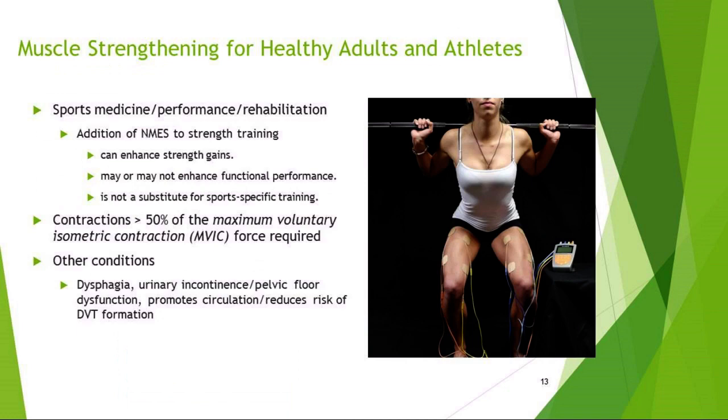So muscle strengthening for healthy adults and athletes, this is very commonly not done. Very commonly not done. It's kind of like a double negative. Anyway, it's not usually done in a physical therapy setting. It's more often done in a sports performance, athletic training, research type setting.